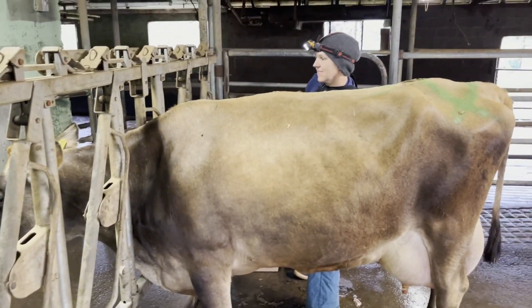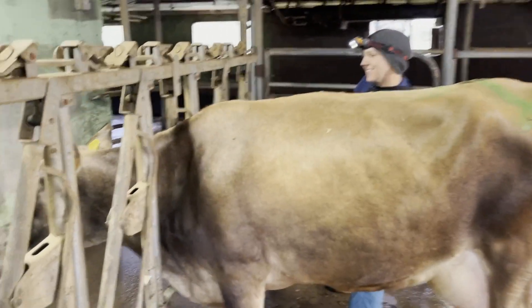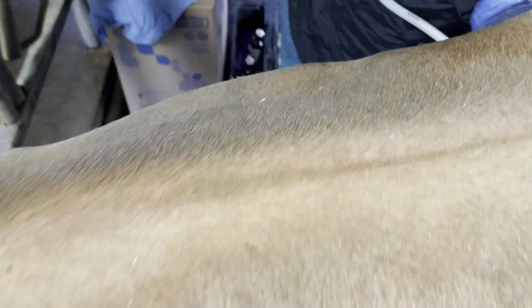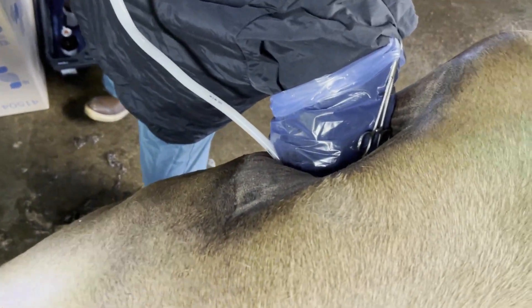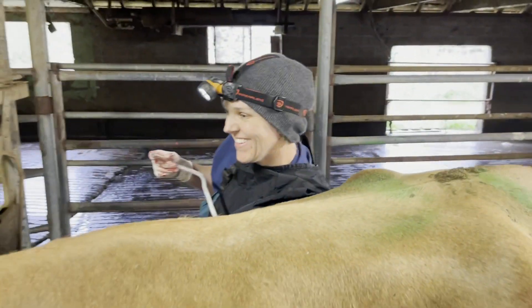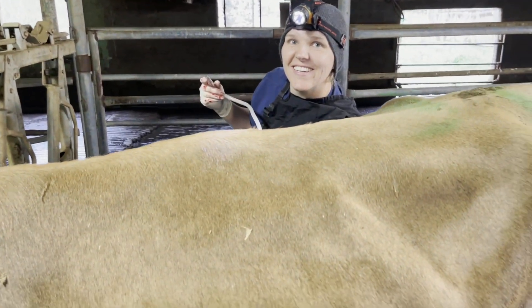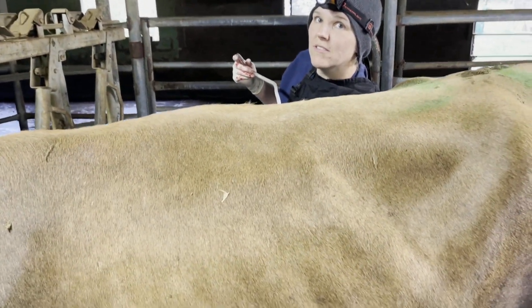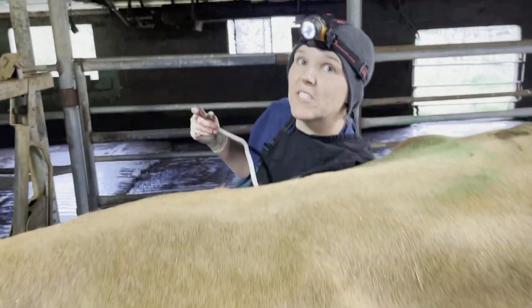From this side it just looks like Tracy's hanging out, cow's chilling. But if you go up and over, her arm is in the side of the cow. So Tracy, while we're letting the air out, this feels like a good time to talk about why we do a surgery instead of the roll and toggle.